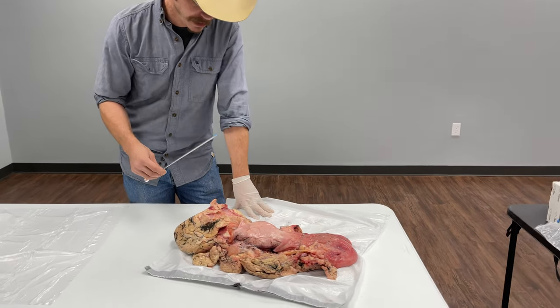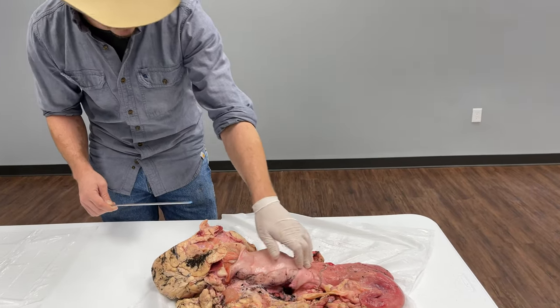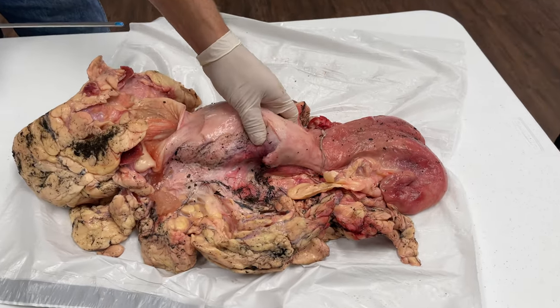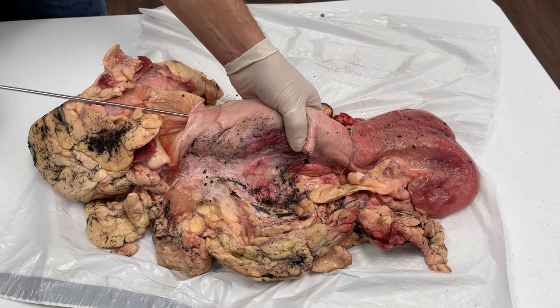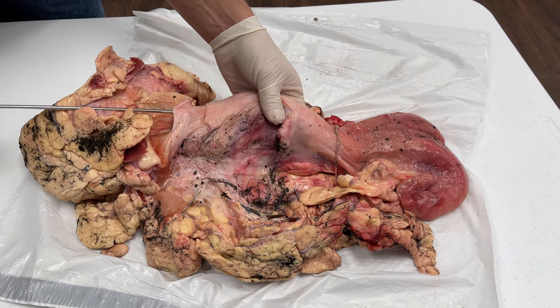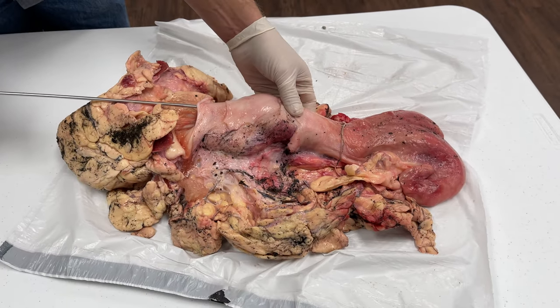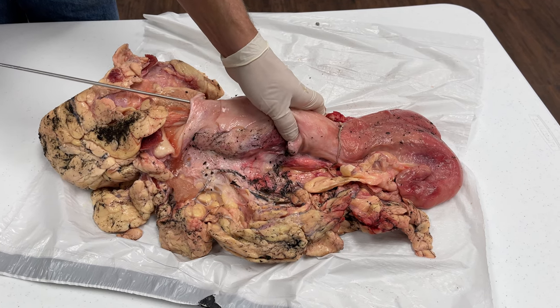Once we actually start to breed, we're going to palpate the cow with the left hand and find the cervix. You're going to do a sweeping motion to find it — it's a lot easier to do on a track on the table than in a cow. I can tell right here is the end of the cervix. I grab that cervix, hold it in my hand, and work the rod in. Once we enter the cervix, there are some rings in there — little fold-type things you have to work the rod through.